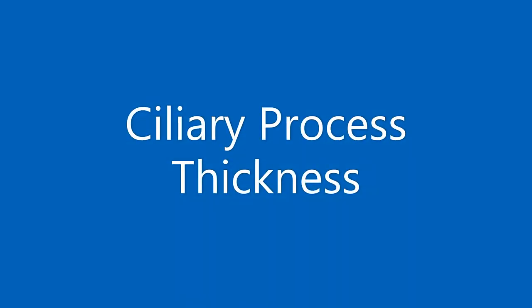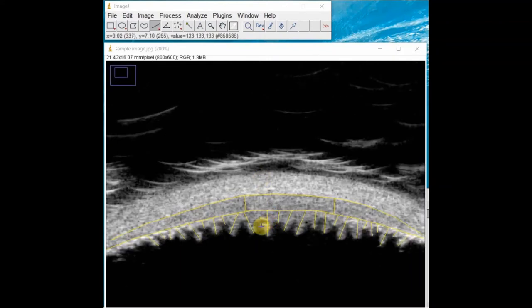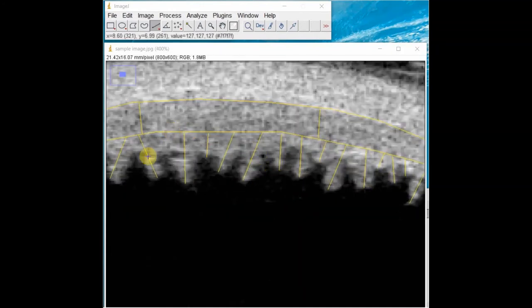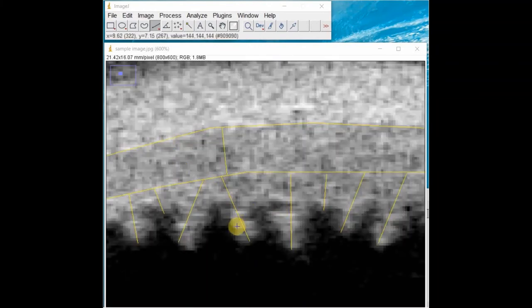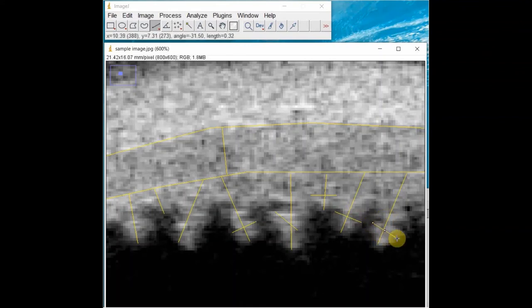Next, we will measure the ciliary process thickness. Around the center of the row, find five ciliary processes. Measure the thickness of each of these five ciliary processes by measuring at the widest portion of each ciliary process. The line should be perpendicular to the ciliary process length line previously drawn. However, if perpendicularly bisecting it would not give an accurate representation of the width — for example, if the process was bent — then measure the width at an angle that more accurately represents the true width. Hit Ctrl-M to measure the thickness of each ciliary process and Ctrl-B to overlay the lines. The parameter measurement is the calculated average of the five ciliary process thickness measurements.